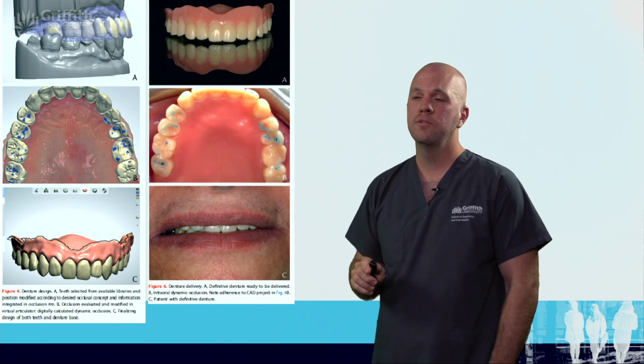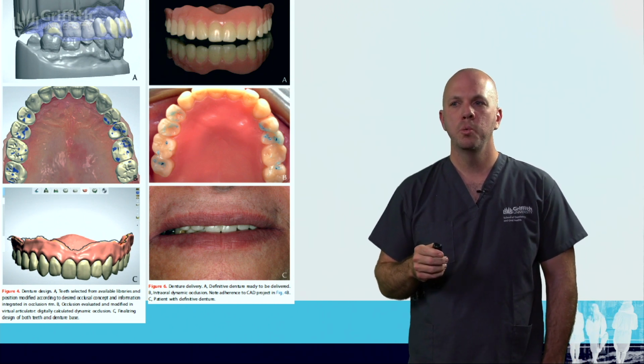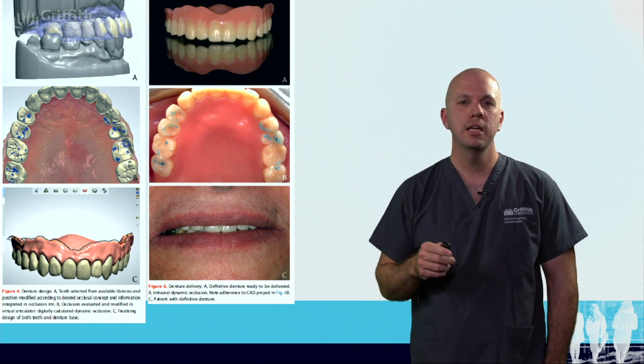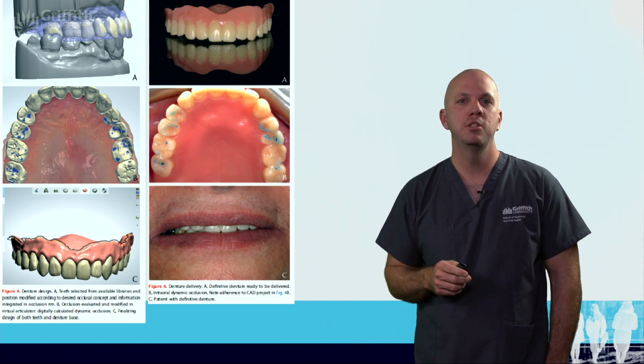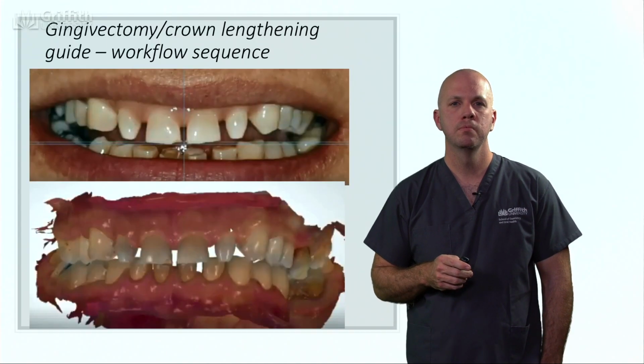The advantage to this for the patient is less chair time. Also, we can actually end up with higher quality end results. And if the patient ever loses the denture, which believe me does happen, we have the digital file there. So we can just mill or print another denture for them.